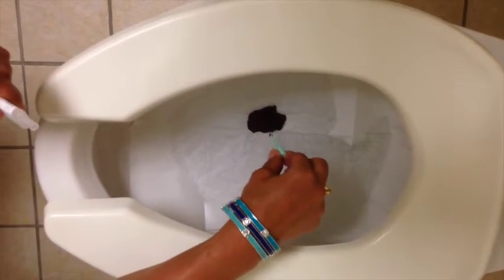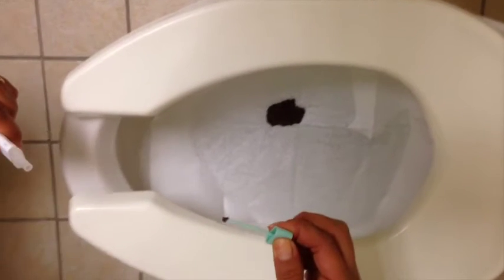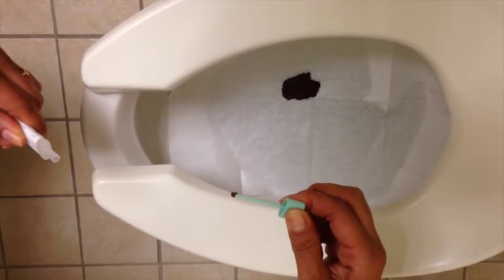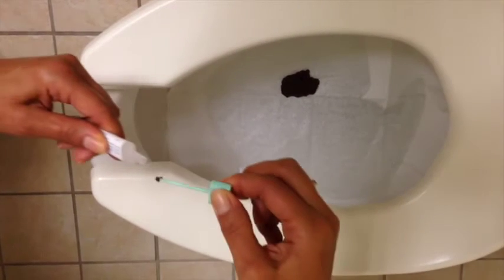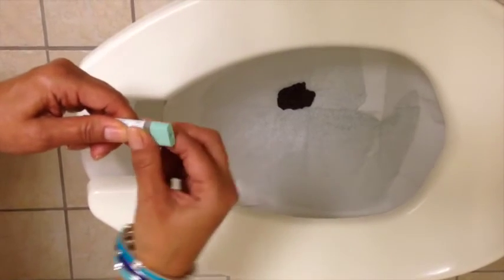Scrape the surface of the stool sample with a sample probe. Cover the grooved portion of the sample probe completely with stool sample. Close the sampling bottle by inserting the sample probe and snap the green cap on tightly.